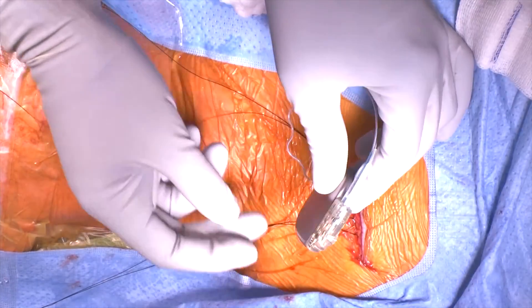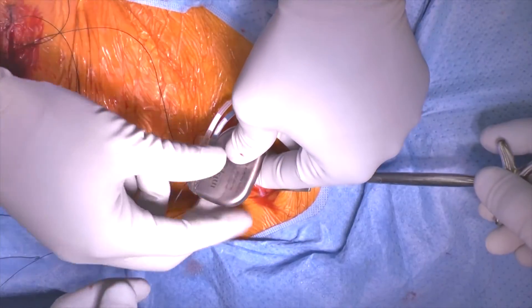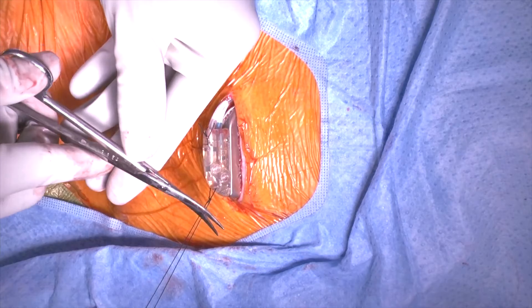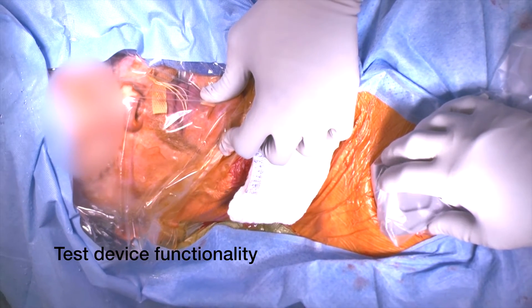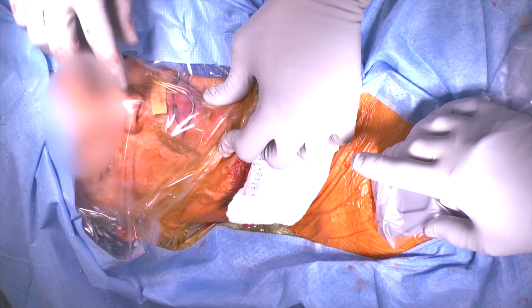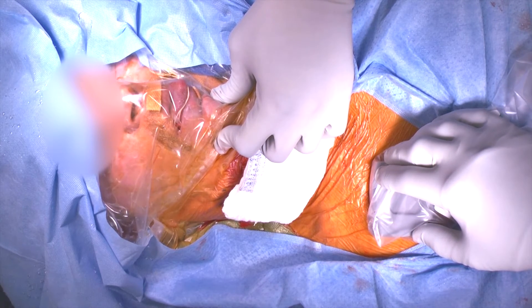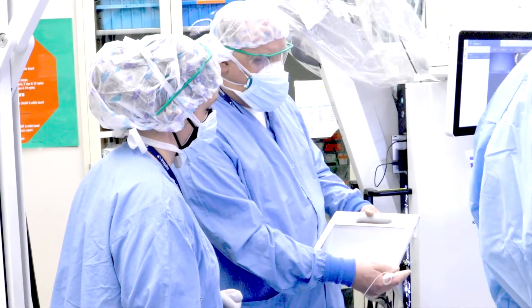The anchoring sutures are then attached to the implant pulse generator. The leads are placed on the back side of the IPG and it is inserted into the pocket. We then tie down the sutures and go ahead and test for functionality. In the testing portion, we're starting at a higher level of stimulation to see excellent tongue protrusion and then backing off our voltage to ensure that no retrusion of the tongue is noted with stimulation at lower levels. If this occurs we would have to go back and reassess the nerve branches to ensure that we don't have a retrusing branch within our stimulation cuff.